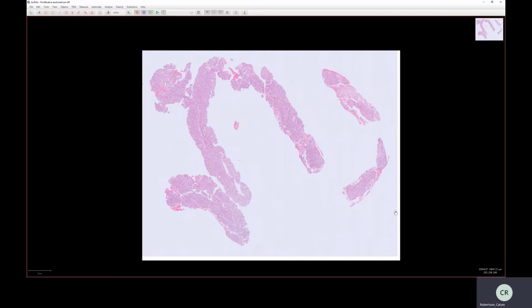So this is a biopsy. In contrast to the last section, which is a full section through the uterine wall, obviously you can't do that in normal practice when you're just taking a biopsy. So what we tend to get is a superficial fragment containing endometrium only, with no myometrium. Often this is actually quite a good sample with quite a lot of tissue. Generally, it doesn't. We get samples that are quite a lot smaller than this, which can add to the challenge. But this is a good amount of tissue here.